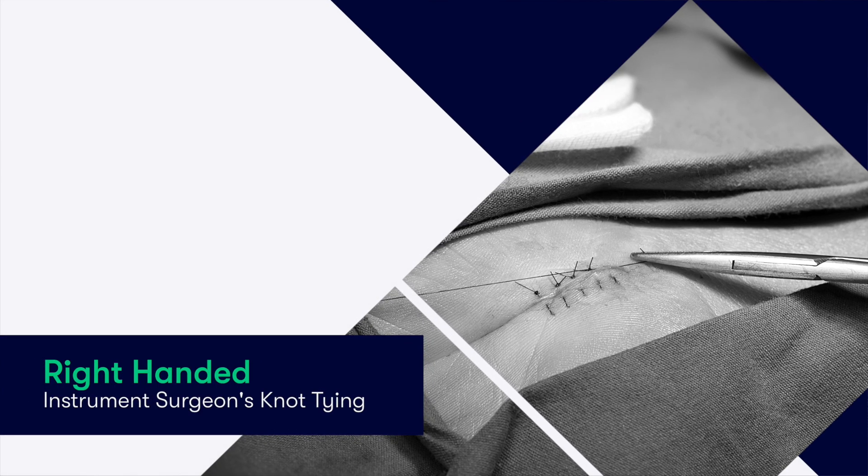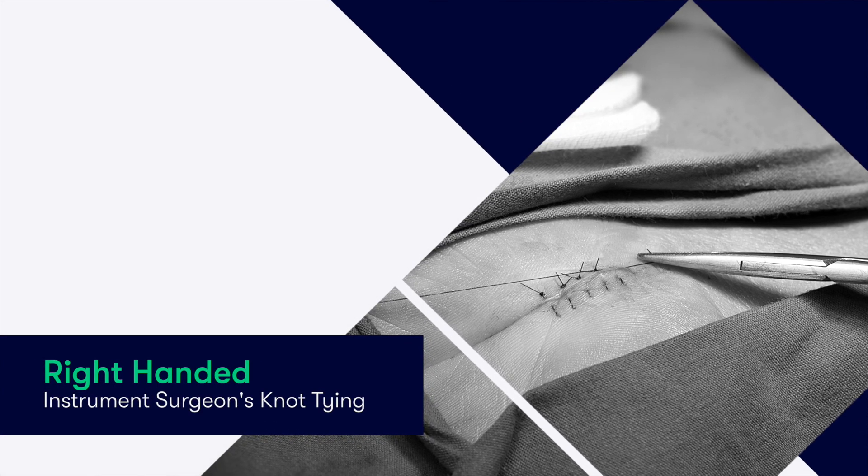We will start by demonstrating the process with the instrument in our right hand, and then later we'll show using our left hand.